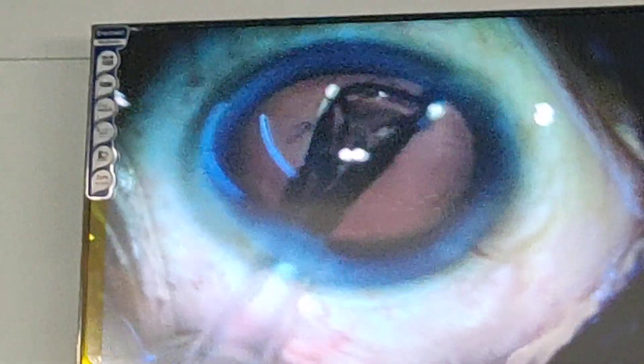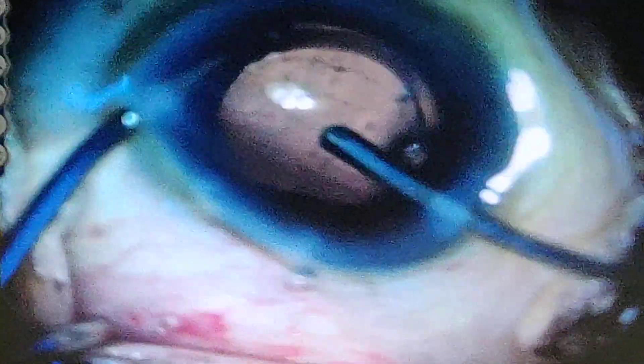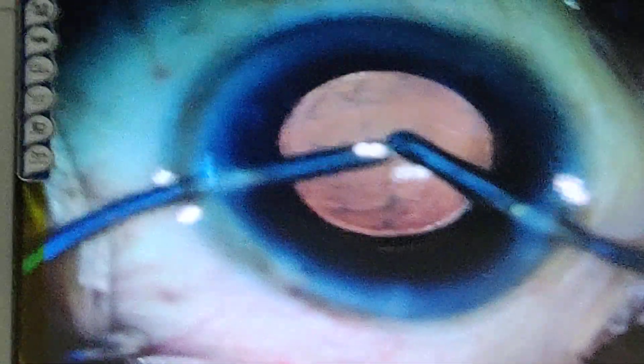This is an excellent device and you can see the delivery of the lens very nicely. You can see the removal of the viscoelastic with the bi-manual irrigation-aspiration system. Once the viscoelastic is removed, the lens is beautifully centered into the capsular bag, as you can see.